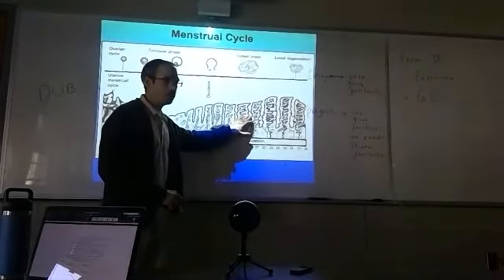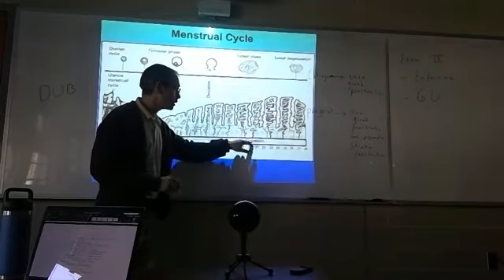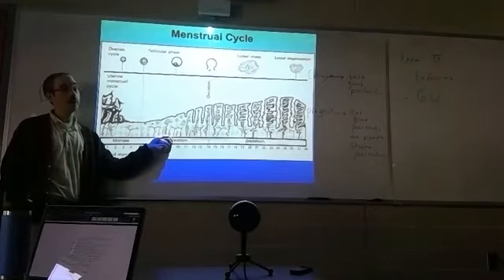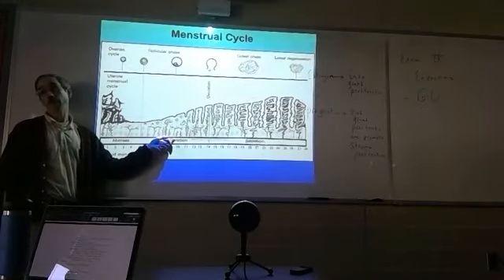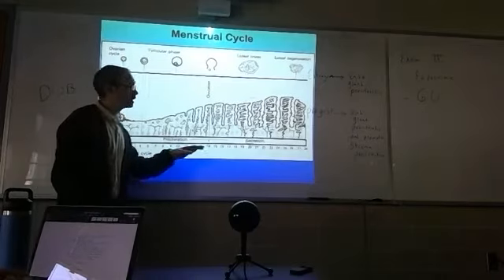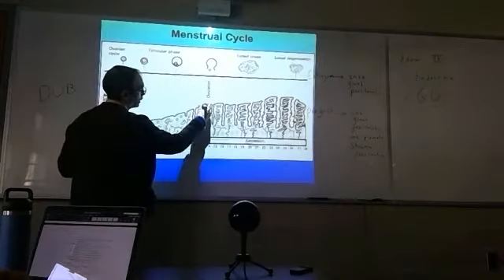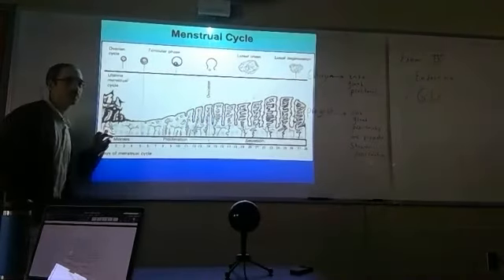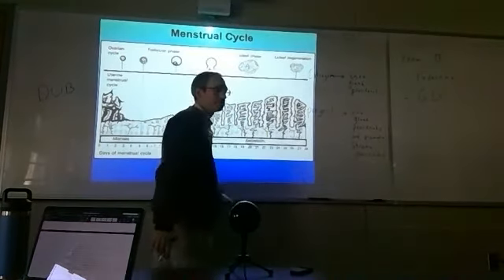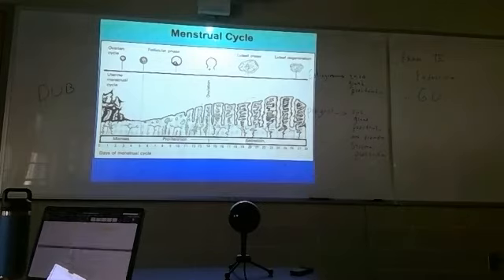If we biopsy the endometrium and discover that it, which should be in the secretory phase, is actually in the proliferation phase, we know she's being subjected to too high levels of estrogen without properly balanced progesterone. There are differences in the histology of this endometrium we can notice. For example, in the proliferative phase, you see how straight these glands look? In the secretory phase, these glands are very convoluted. Very easy to identify proliferative endometrium from secretory endometrium.